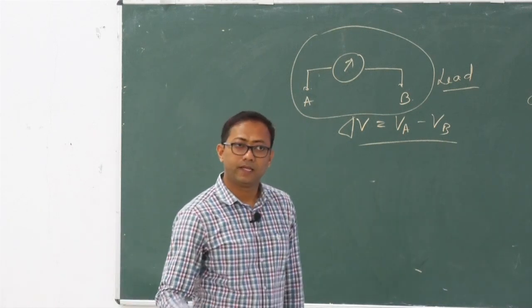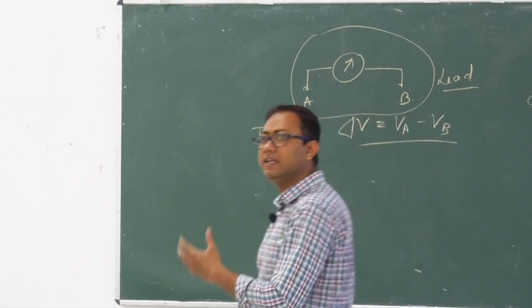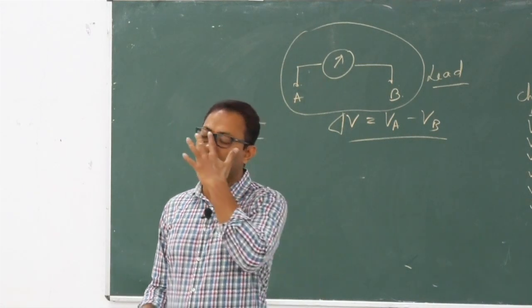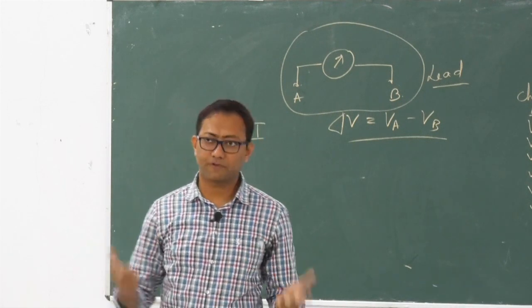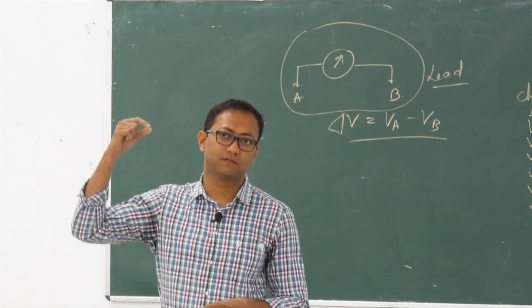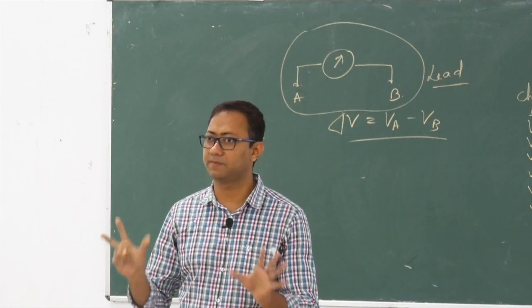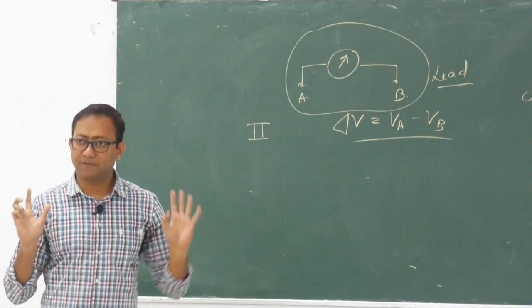While measuring any electrical activity, for example electrocardiogram, the electrical activity of the heart, electroencephalogram, the electrical activity of the brain, or nerve conduction studies, you will get leads. Lead simply means a pair of electrodes with a voltmeter in between. In ECG we have 12 leads.